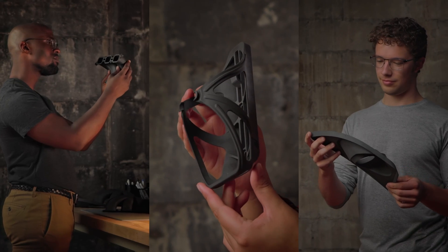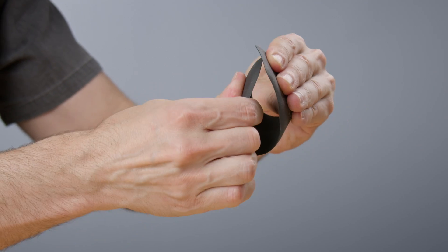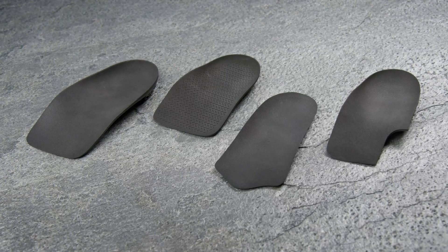Formlabs prides itself on expanding access to digital fabrication to enable anyone to make anything. Without compromising on quality and durability, we offer the most affordable and easy-to-use 3D printing solution for insole shell production on the market.